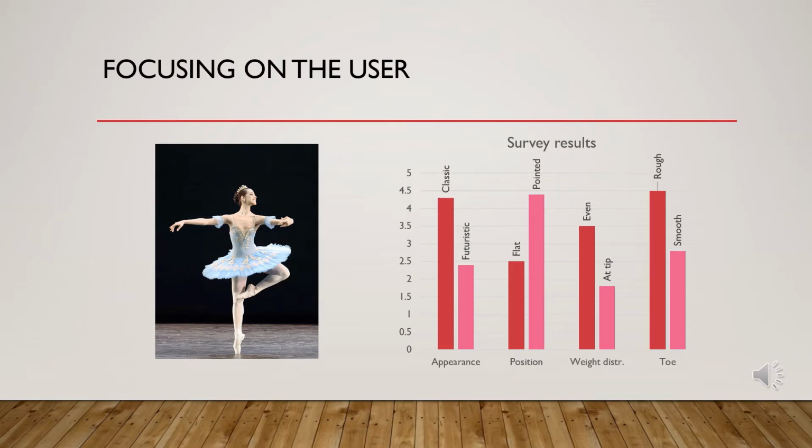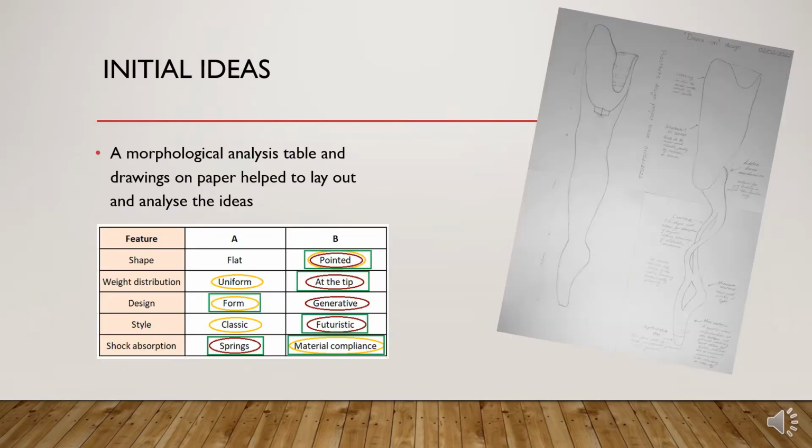As the prosthetic provides no feedback to the user other than the pressure felt by the residual limb, they might not realize the contact with the floor is unstable and there might be a risk of slippage. The rough tip would minimize it. However, at the same time, it must allow for rotation, which is why I decided to include a bearing mechanism. This means the tip will be stationary and with a good grip with the floor whilst the rest rotates.